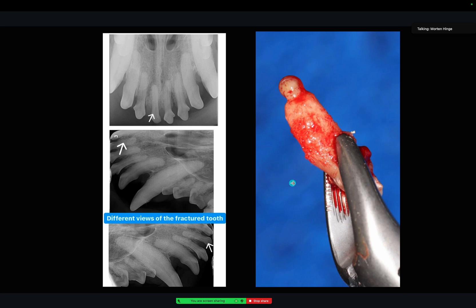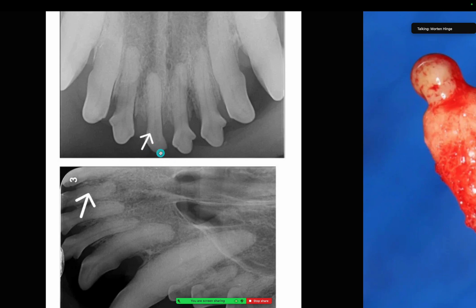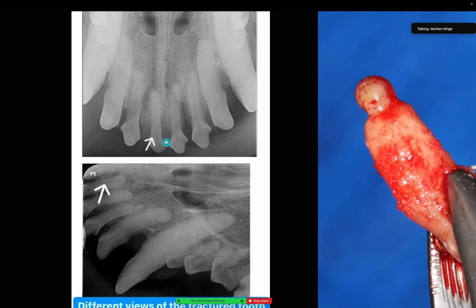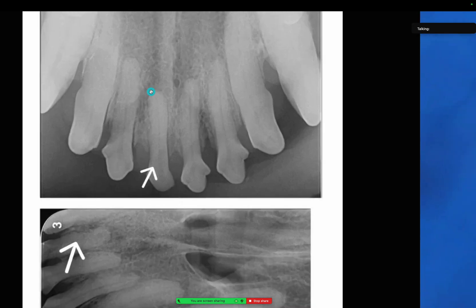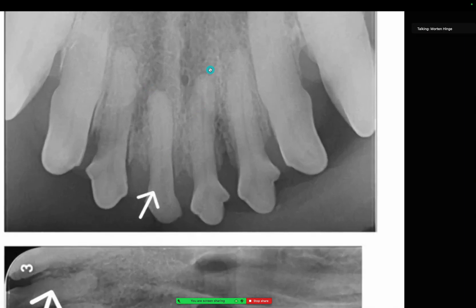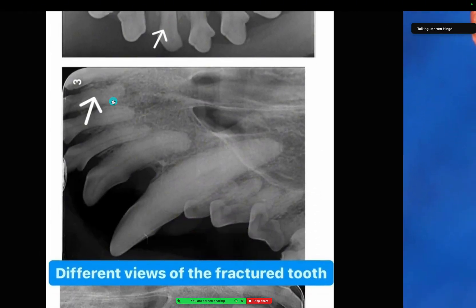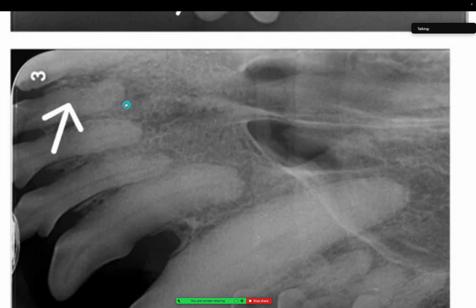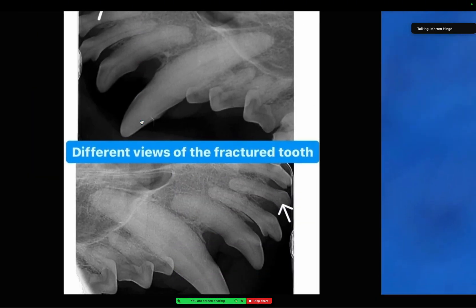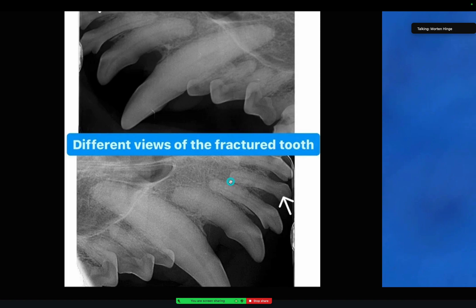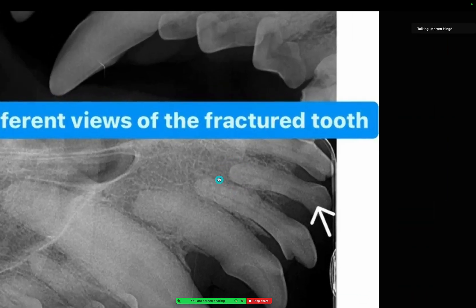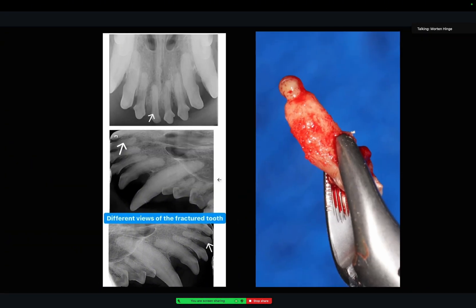Sometimes they get very hard to see. The only reason I really wanted to get this tooth out is because it had a fracture here. But looking at this root tip, you don't see that distinct line — it's a little blurry. When you look at a different projection, you also see it's a little blurry, a little bit of darkness here. And you check it from the other side and you see a little bit of the same. Always, if you are in doubt, take more angles — just take more angles.